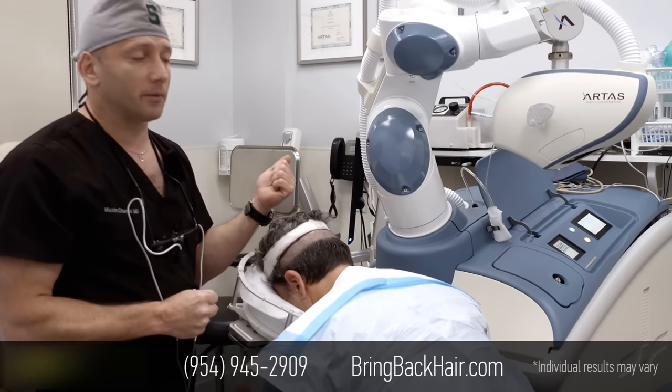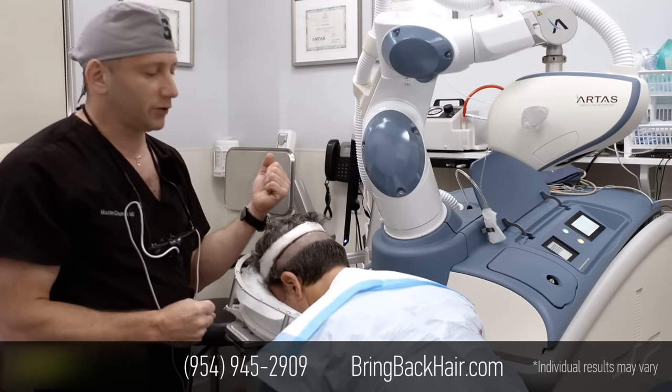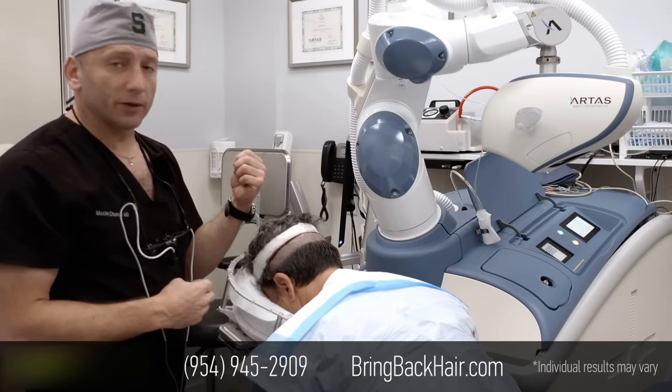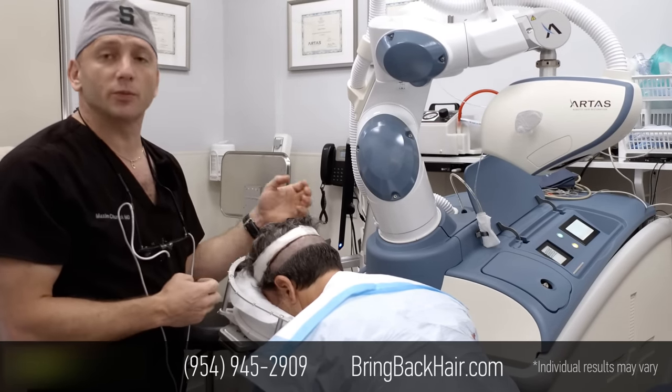We're using the 9X robotic hair system. It's the most recent upgraded version of the robot, with 30% faster extraction and increased precision as well.